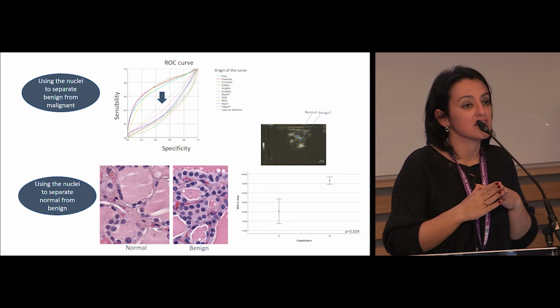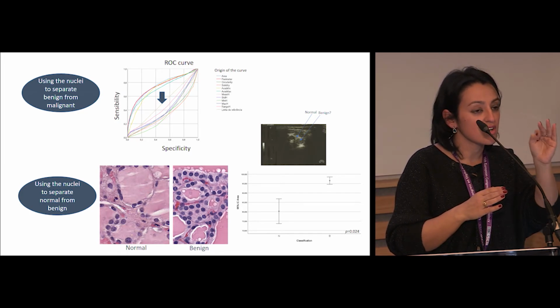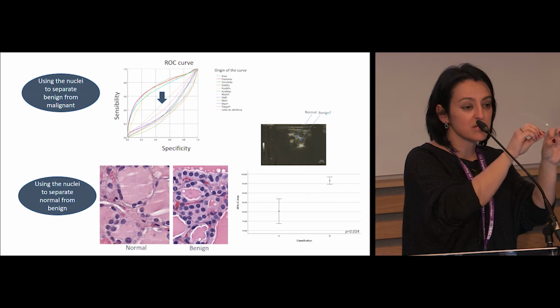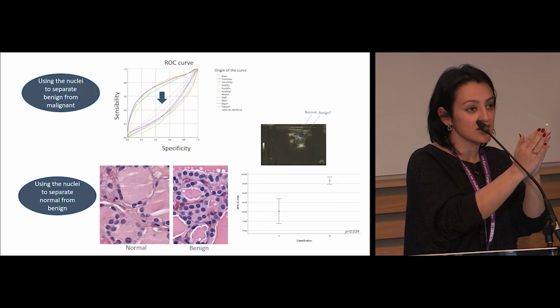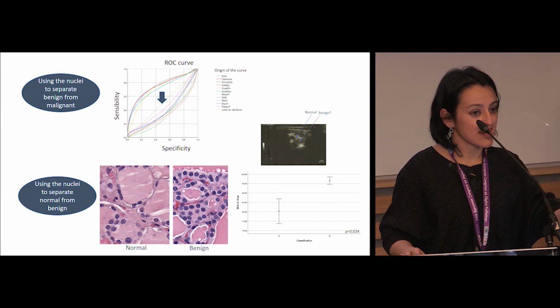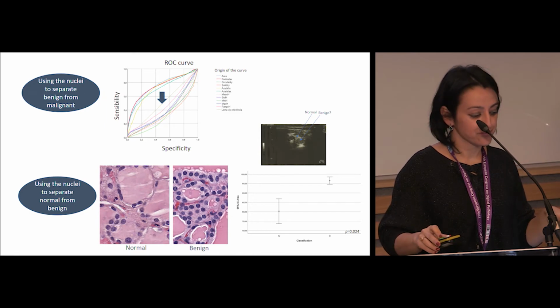In preoperative diagnosis, if you have scant material with small dark nuclei, we don't know if you are puncturing the nodule or outside the nodule. The appearance is the same, and that's the reason why we have strict criteria for adequacy of sampling when it concerns cytology of thyroid nodules. And you realize here that the area is a very good tool to separate these, okay?